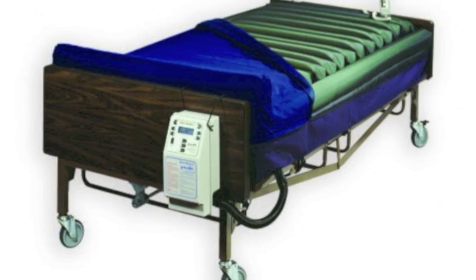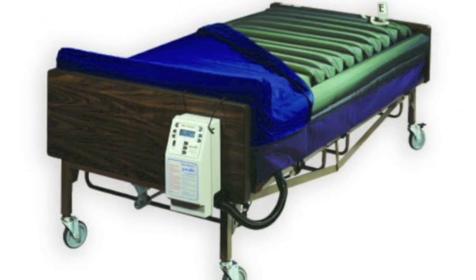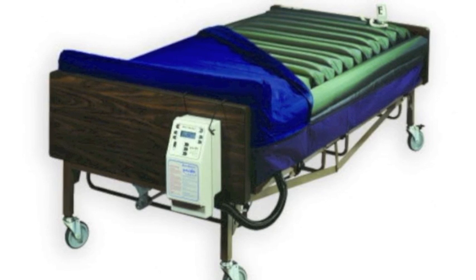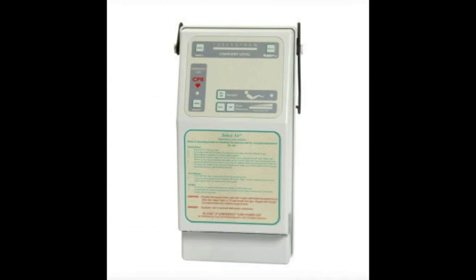Ensure that the power entry switch is off and firmly place the power cord into the unit. This should be on the side of the unit underneath the power entry switch. Plug the other end of the power cord into a grounded wall receptacle and switch the entry switch on. On the control unit, push the button so it reads on. This button is directly below where it reads CPR on the unit. Once this button is on, the mattress should begin to inflate. Allow the mattress to fully inflate before transferring the patient onto the bed or switching any controls.